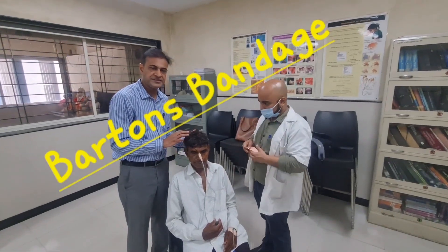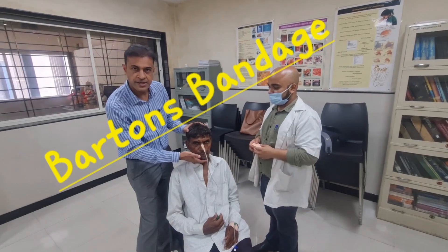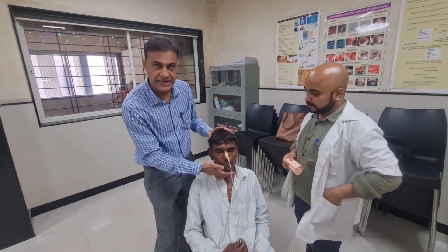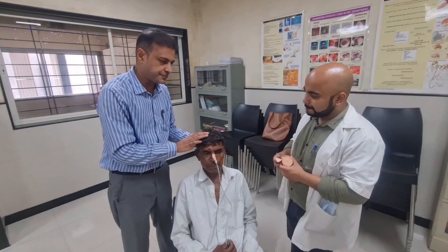We will demonstrate how to apply Barton's bandage. This is a bandage used to support the mandible, generally applied after we have reduced a TMJ joint dislocation or after a mandibular fracture. Dr. Aviruk will demonstrate this method.